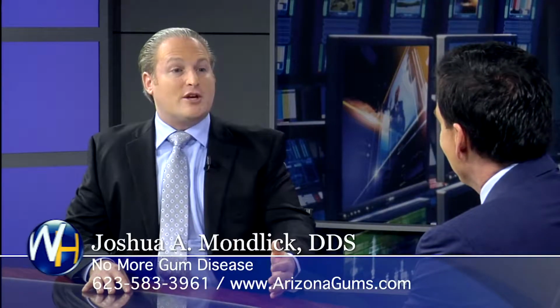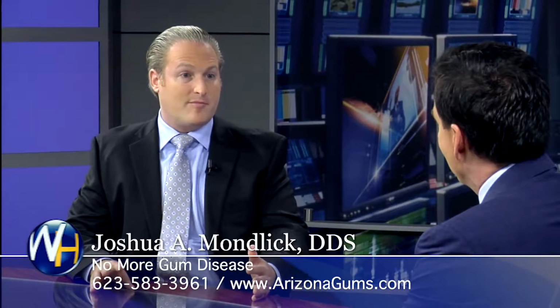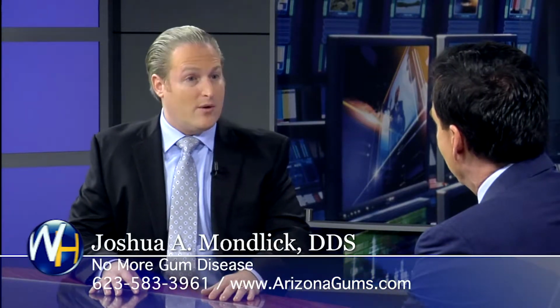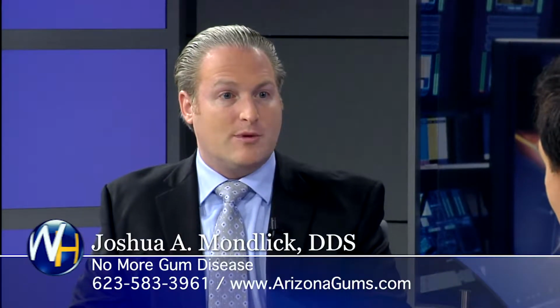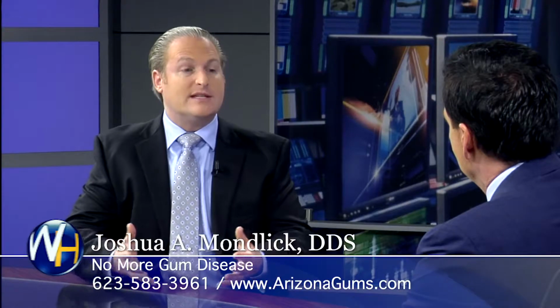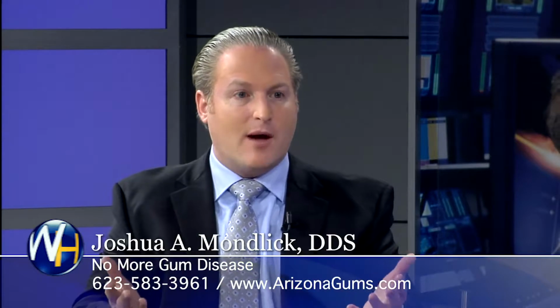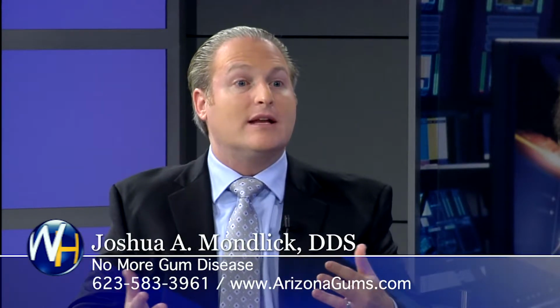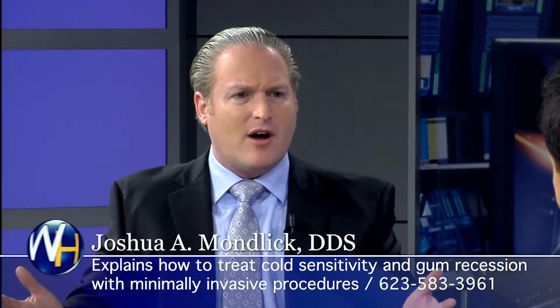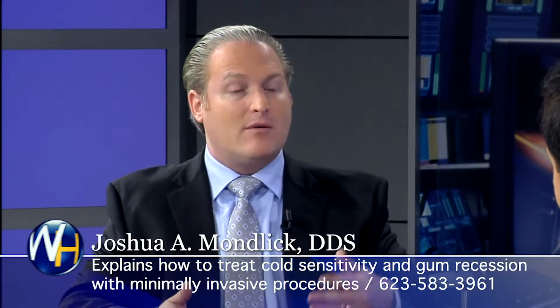So traditionally, these patients will come into our office, and I can tell right away when I walk into the exam room that they have extensive periodontal needs because I can smell it, Randy. Oh, really? Oh, yeah. After I finish my examination and we determine the extent of their problem, we have to actually cut open the gums to get access to where this diseased tissue is and where the bacterial infection is around the tooth. So you're actually peeling the gums back. We're peeling the gums back, and once we have the gums open, we're able to get great access to clean the roots and get everything nice and clean, get rid of the pus, get rid of the infection, get rid of the microscopic bugs. When we're finished, we have to put the gum tissue back, put stitches in, sew up the gums, and then send the patient home.